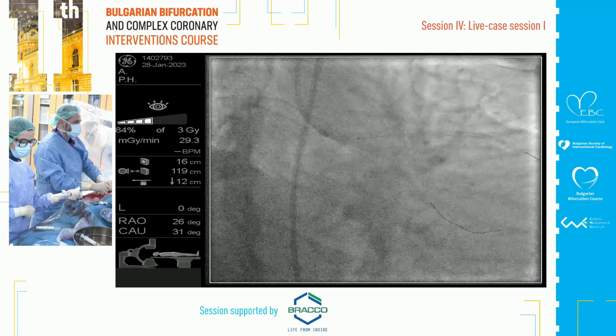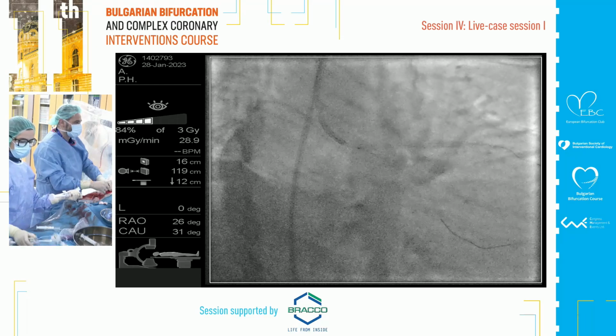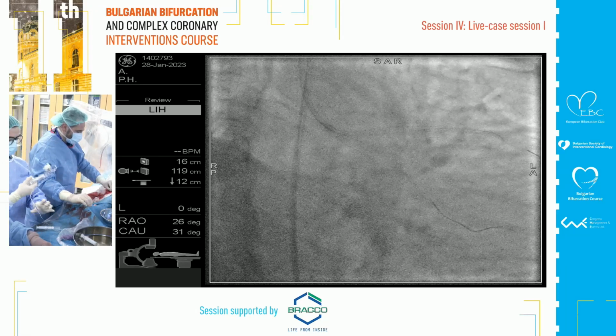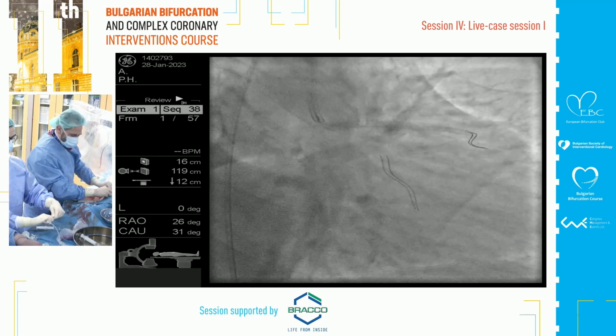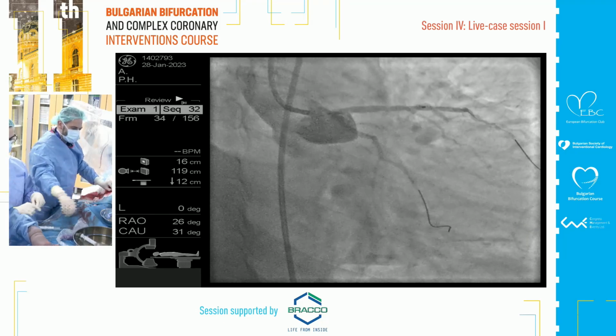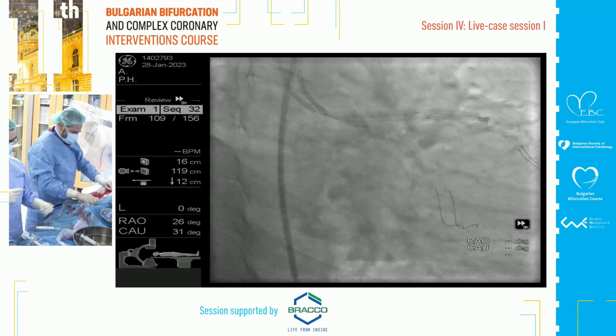In the past with old stents, having twisting was a catastrophe. Okay, so we perform the final part. Now we check for answers, possibly, and we will have some of the answer to our question.